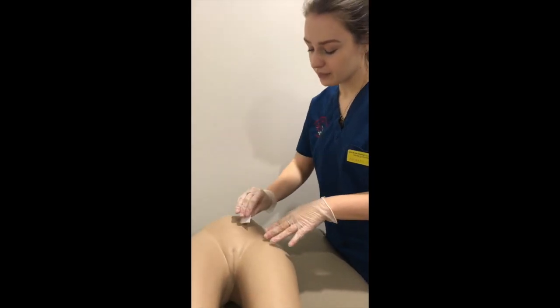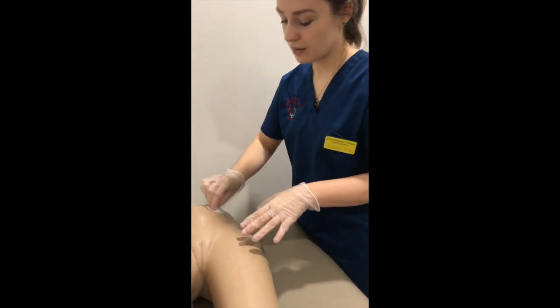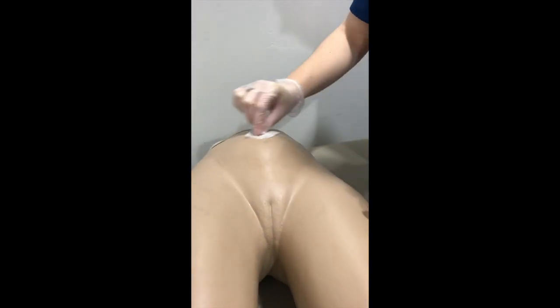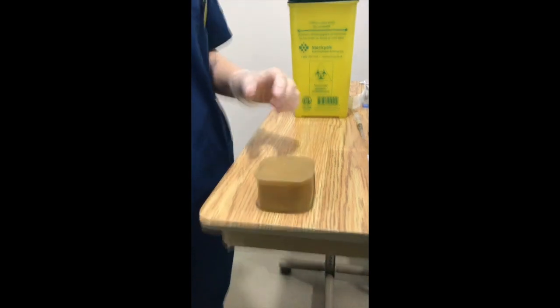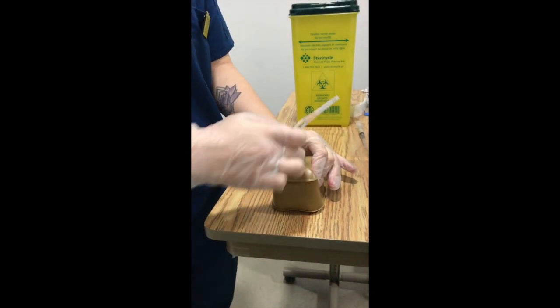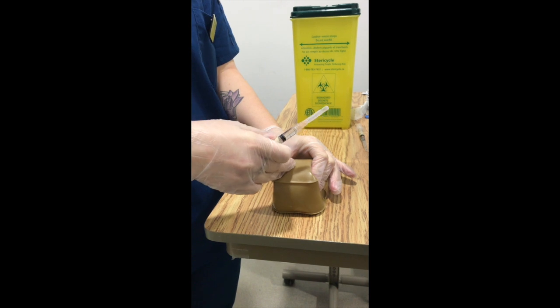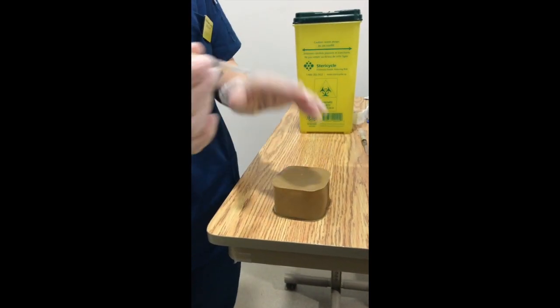Mancini's lower abdomen here, because there is some fatty tissue. And then we're just going to start from the center and clean out in a circular pattern out 2 inches. Okay. All right. And then to perform the injection, for a subcutaneous injection, you want to pinch the skin up so there's a nice big layer here, because you want to inject this into the fatty tissue right below the skin.